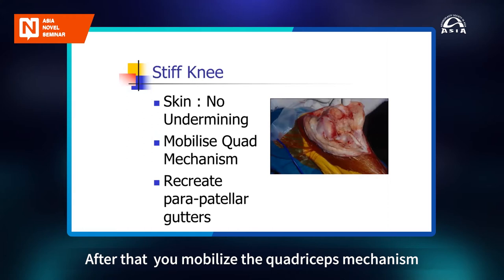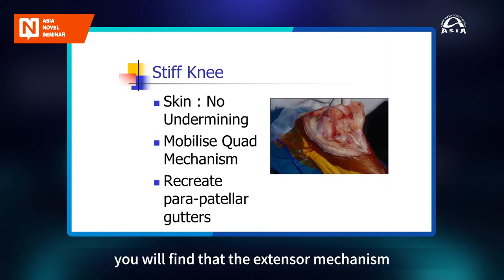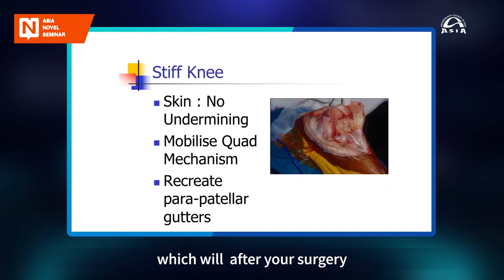After that, you mobilize the quadriceps mechanism. On both sides, you will find that the extensor mechanism is stuck to the bone right on the lower femur and upper tibia. So as a first step, take a diathermy or cautery and recreate the parapatellar gutters, which will, after your surgery, let the knee flex and extend. If the soft tissue is stuck to the bone, there will be no movement later on.